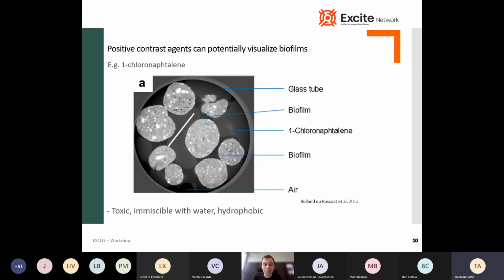Another example of a positive contrast agent is 1-chloronaphthalene. That's actually a hydrophobic solution that does not enter the biofilm either, and I show an example here. This is again a column or flow cell with grains in which biofilms grew, and then the surrounding water is replaced by the 1-chloronaphthalene, which has a higher attenuation coefficient. So you can now distinguish it from the water. But also here there are problems with this specific one: it's very toxic, and it's hydrophobic. So if you're interested in how biofilms affect water transport, you cannot study it with this, because it's hydrophobic.